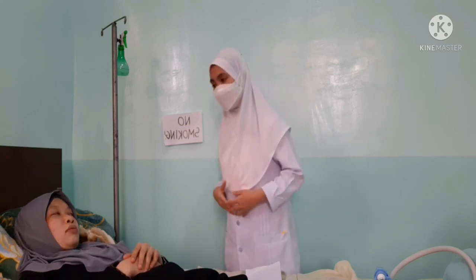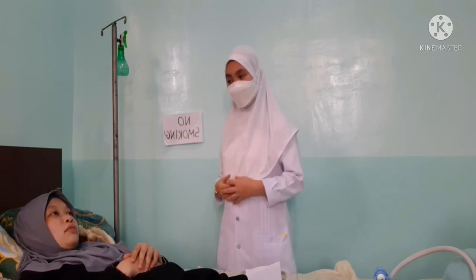So, ma'am, I'm going to do an oxygen administration. Is it okay with you? Now, make sure that the humidifier is filled with sterile water at the appropriate mark.